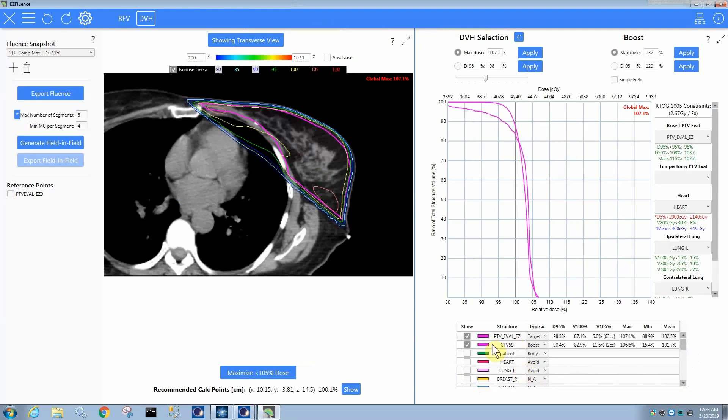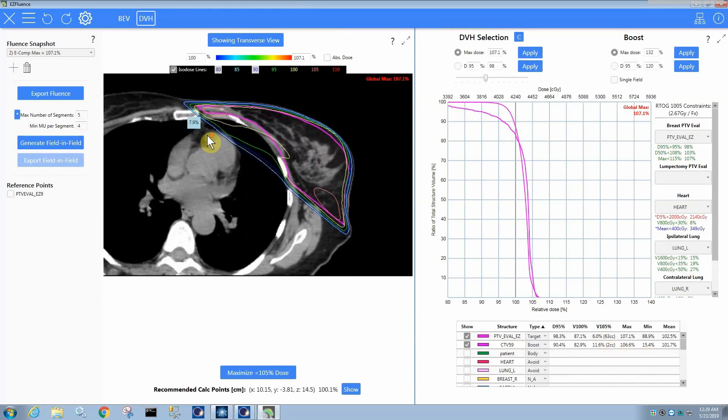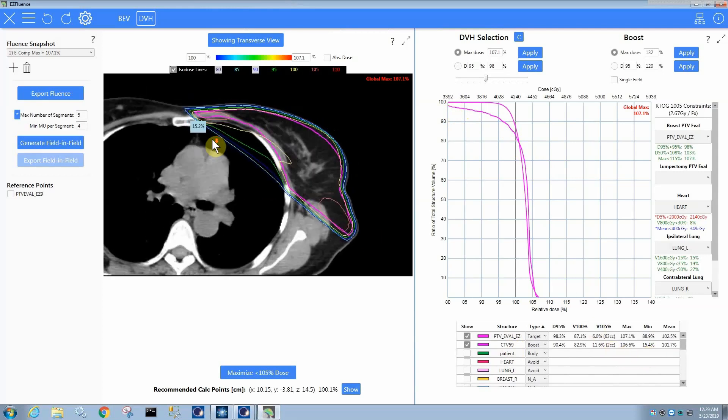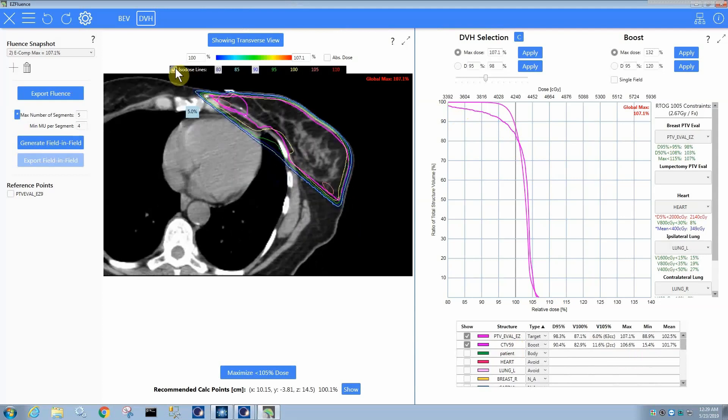So we change the type to a boost. You can see that this structure, this is the curve that represents the CTV59 structure. You can see it doesn't really hit 100. In fact, the min-dose is 15%. So the reason is that this structure actually is... Let's go find it real quick.